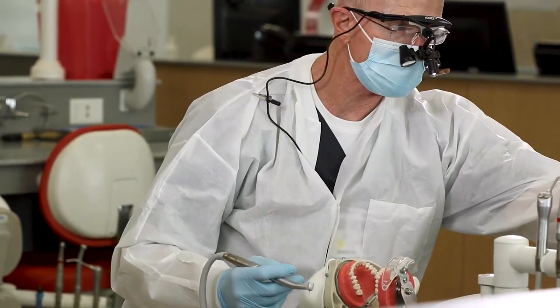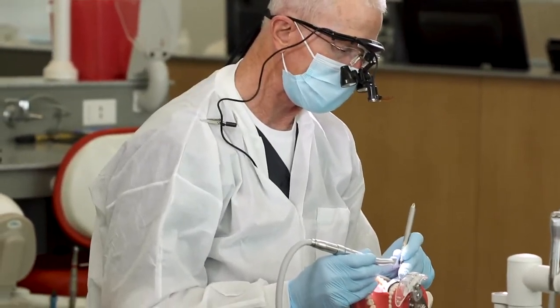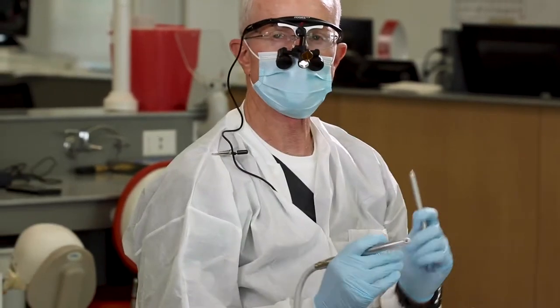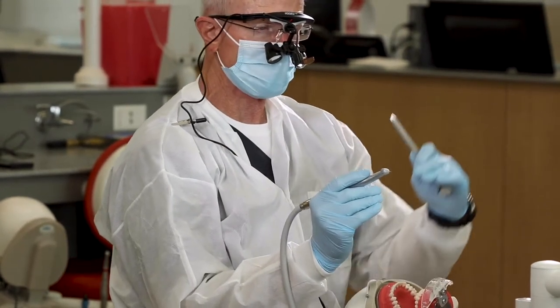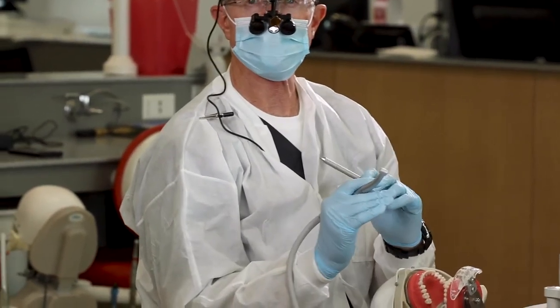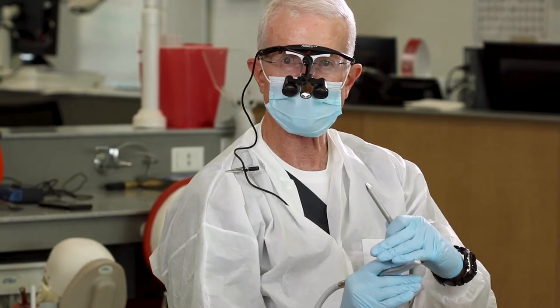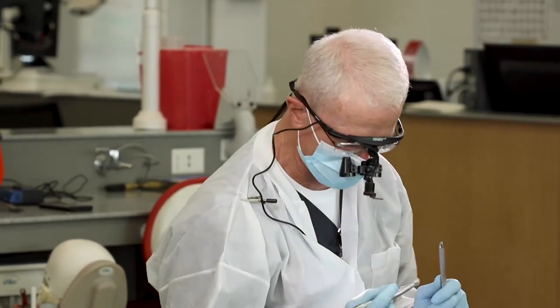With our guide cuts, we're not going to go quite as deep on the distal because we've already got a little bit of space there. The guide cuts — you want to follow your triangular ridges and your major grooves. This burr is a millimeter in diameter, so it's very handy for judging approximately one millimeter of tooth reduction. Our overall target clearance for this preparation is 1.5 to 2 millimeters — that's on the non-functional cusp, the functional cusp, and the functional cusp bevel, so all the way across the occlusion.